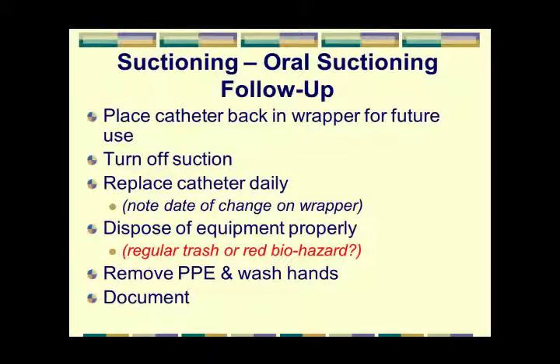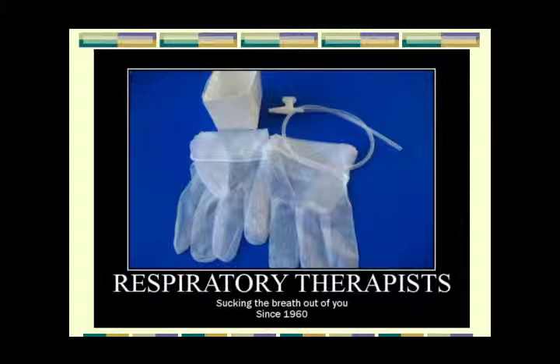Once you're done, turn off the vacuum, and first of all make it quieter in the room. And again, this is a potential for having infectious materials, so you may need a red biohazard bag, and document.